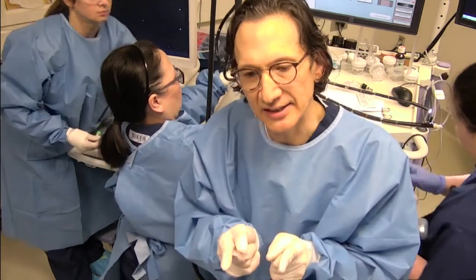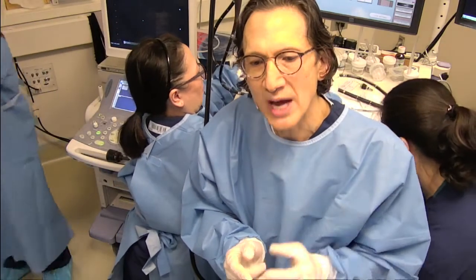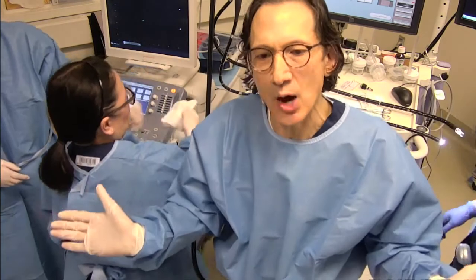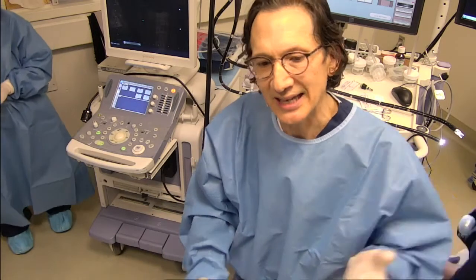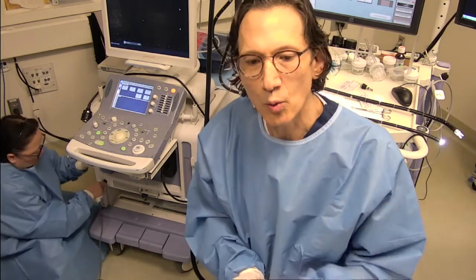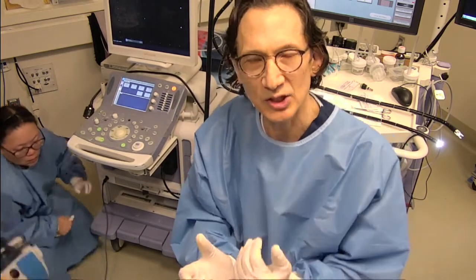And it's a short stent, and it needs to be short because we want to minimize collateral damage. We don't want the end of the stent sticking out against either of the opposing walls, be it the duodenal wall on the other side or the gallbladder wall on the other side, because that can cause injury, bleeding, ulceration, whatever, perforation. Now, in the case of a pseudocyst, we also want the pseudocyst to collapse. So we want to have room for the cyst to be able to collapse.